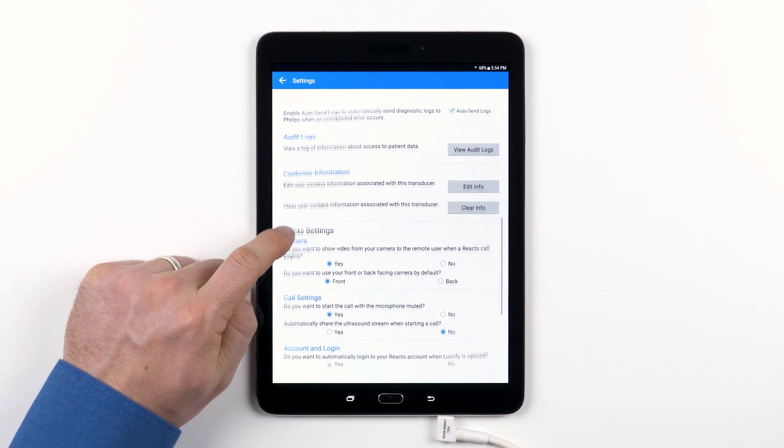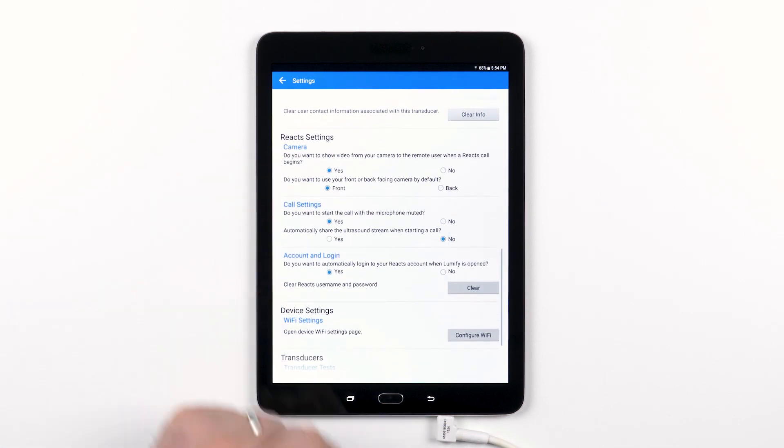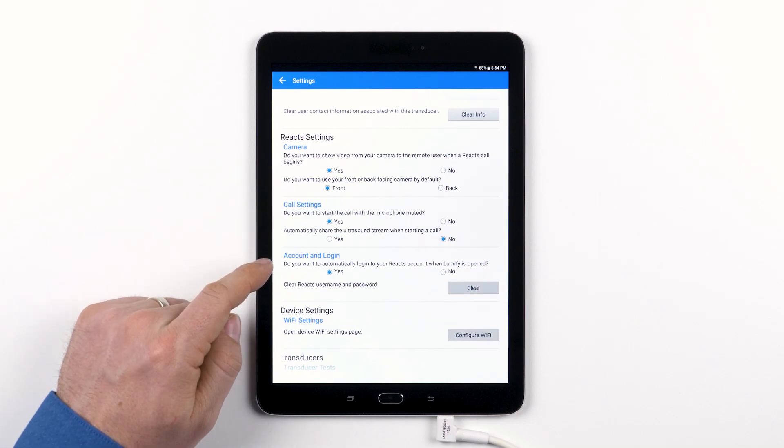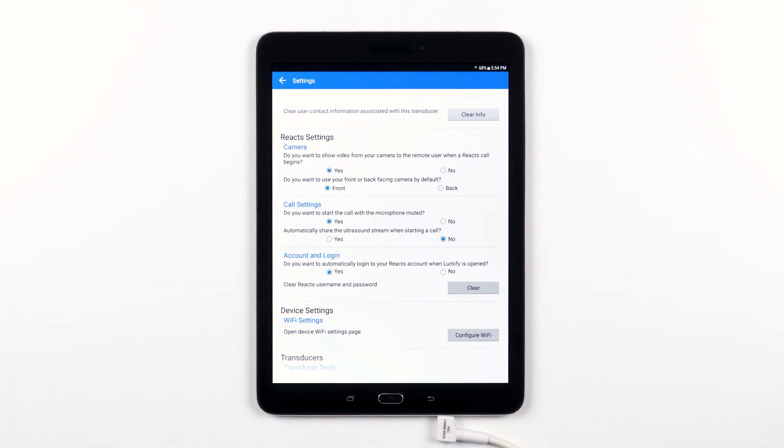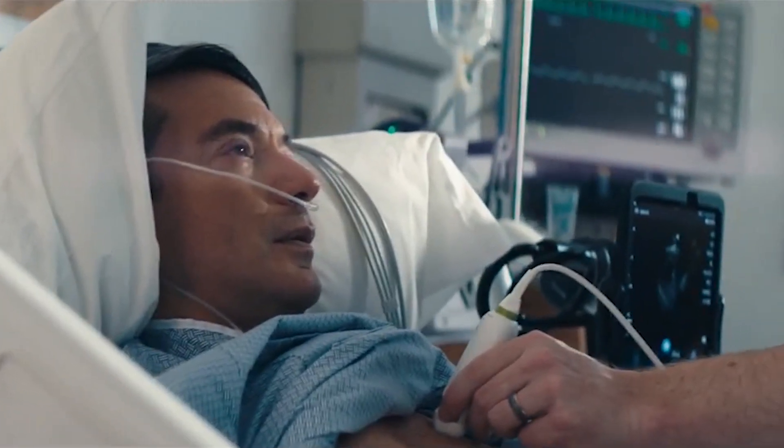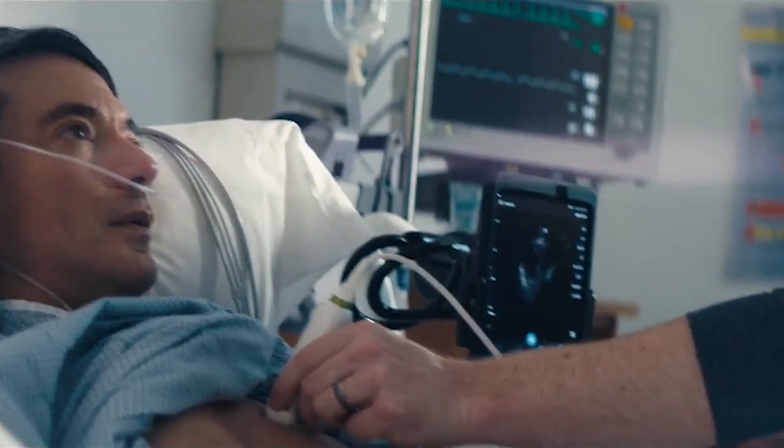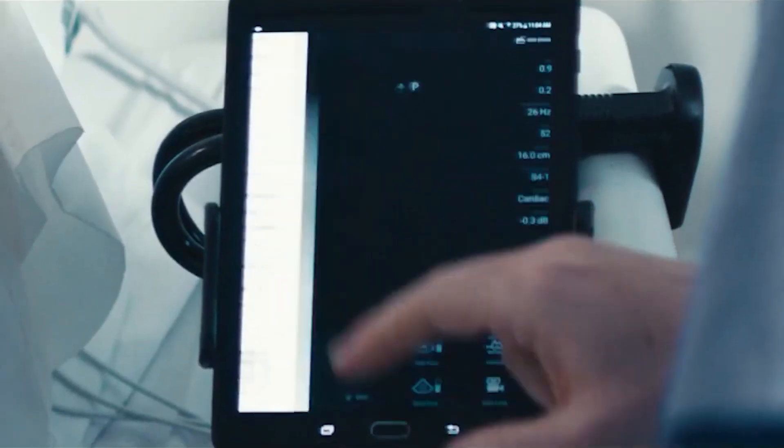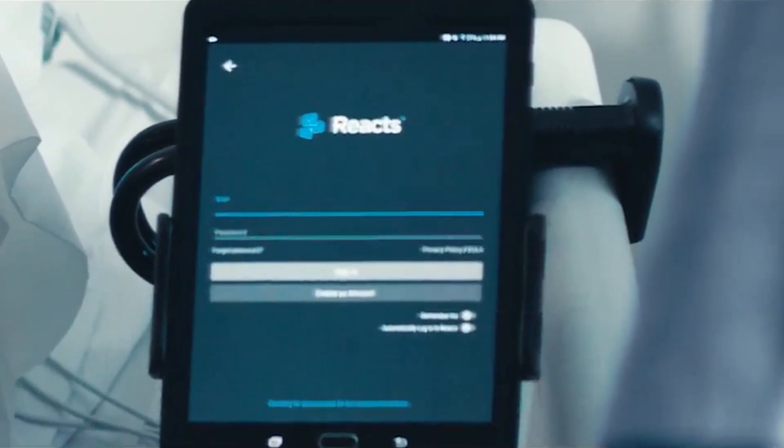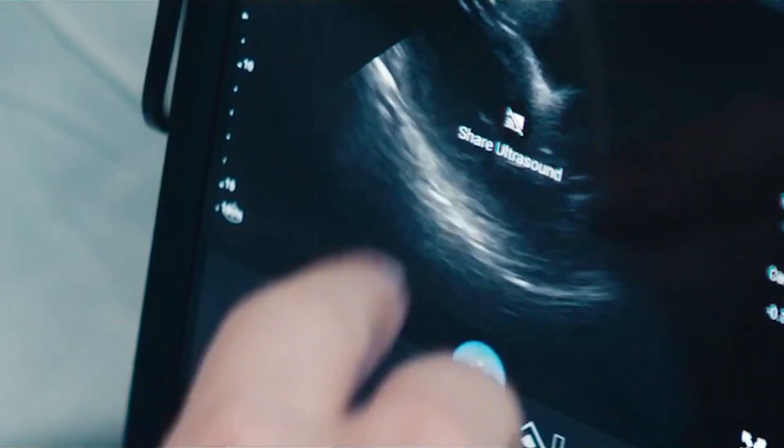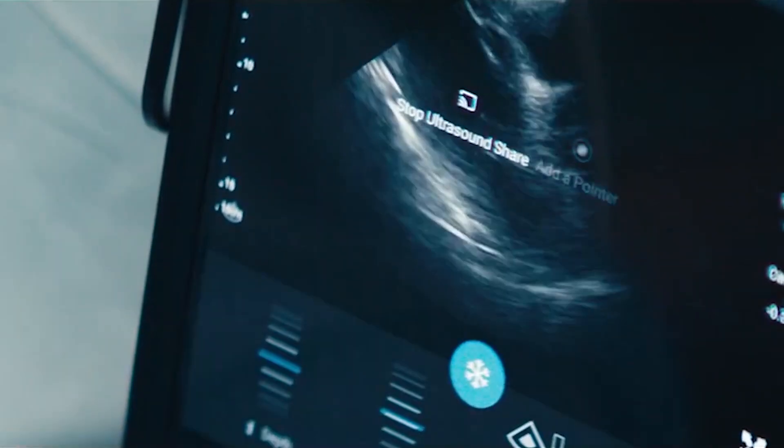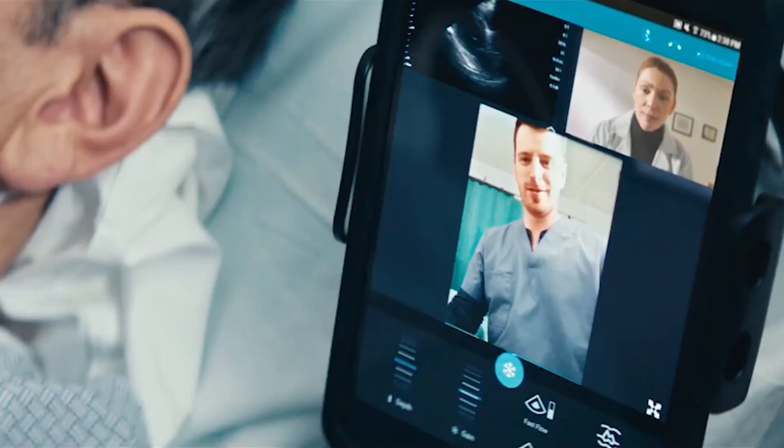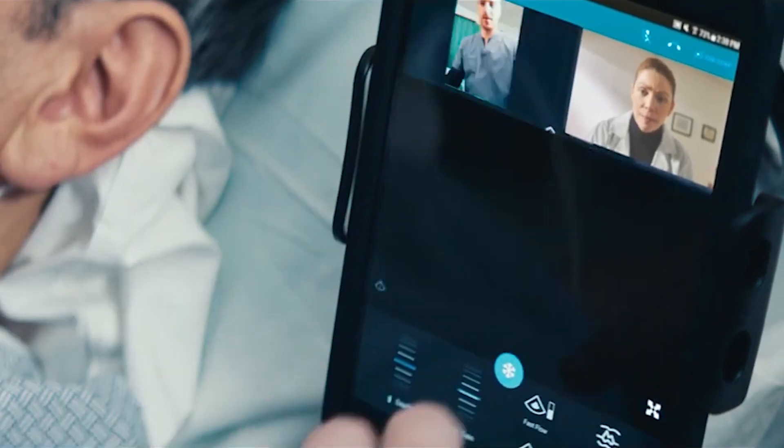The next section is where you have the option to adjust your Lumify Reacts camera, call, and account settings. Reacts is the technology that drives Lumify tele-ultrasound capabilities, giving you the ability to connect in real time when and where health professionals want it, to simultaneously stream your camera, voice, and ultrasound to enhance remote collaboration.